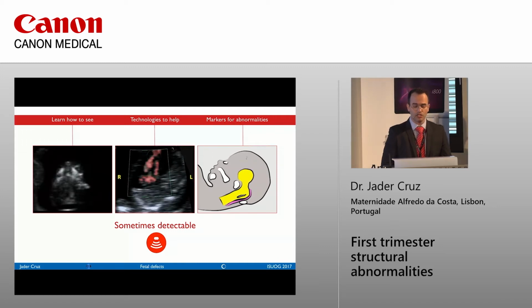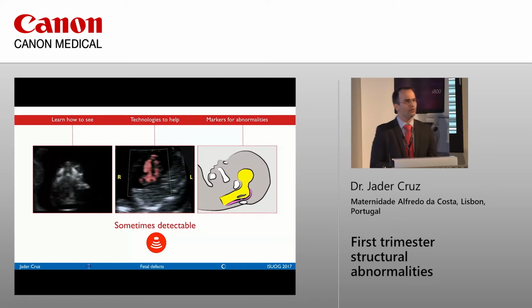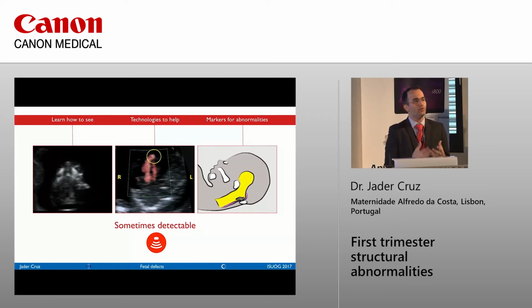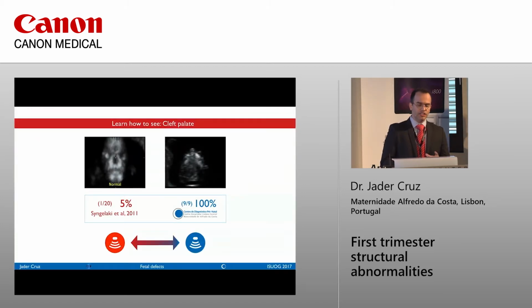of these abnormalities. And I just show here the example of what happens when you have an open spina bifida. You all know the brain is pushed back and down, and therefore the brainstem compresses the posterior fossa. So by measuring either the fourth ventricle, called the intracranial translucency, or making a relation between the posterior fossa and the brainstem, you can think of an open spina bifida.